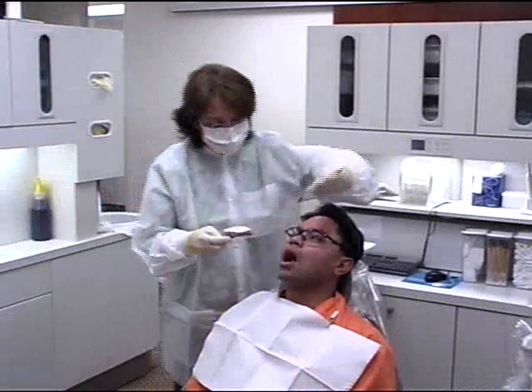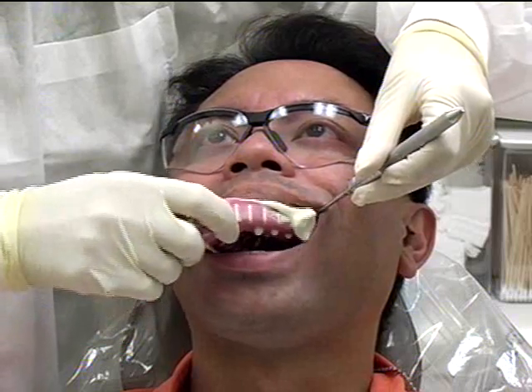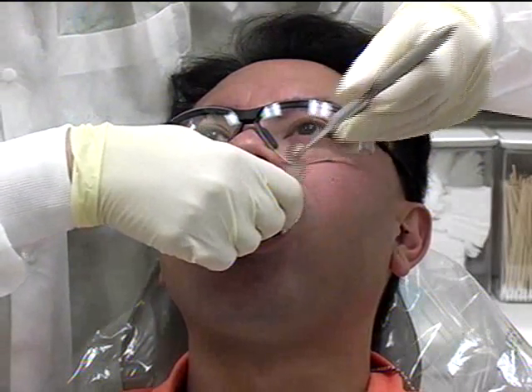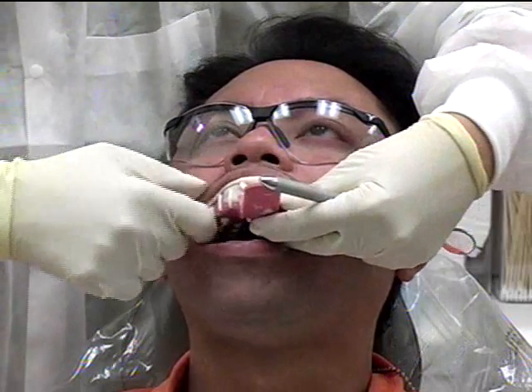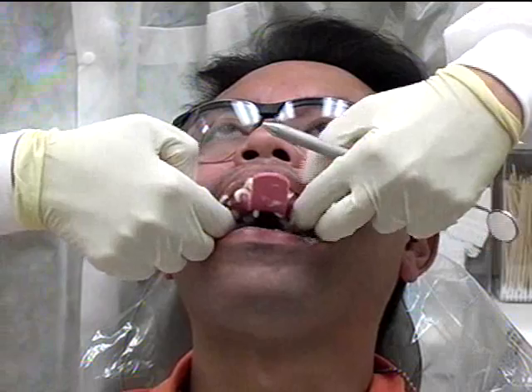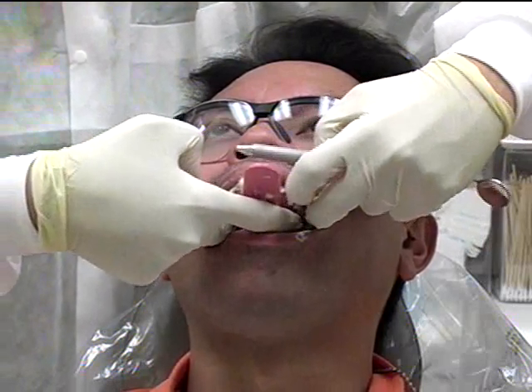Stand behind the patient and with the mirror in the left hand, retract the cheek. Use the right hand to rotate the tray into place. Remove the mirror and seat the tray upward and forward. Do not overseat the tray and allow the material to flow over the flange and forward. Avoid forcing the material into the back of the throat.